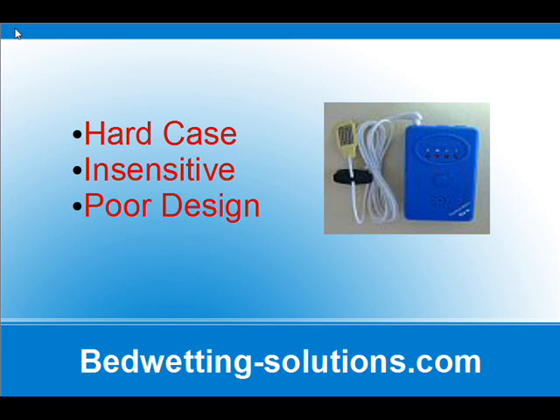Kids don't like sleeping on a little hard box, and those in-pant sensors are never where they're needed when they're needed. And variable sounds are irrelevant and unhelpful, because alarm conditioning is a Pavlovian situation. Change the sound and you've wasted your time. If you let the child choose the sound they like best, he might choose to ignore it or enjoy it rather than get up to go to the bathroom.